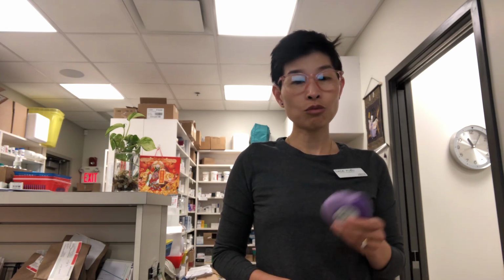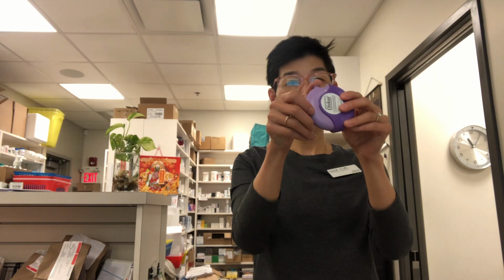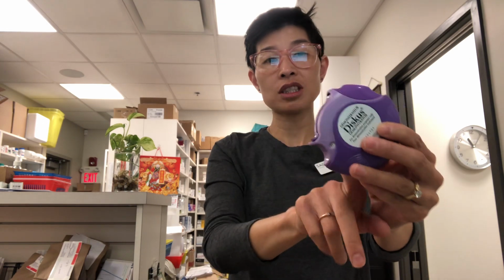I'm one of the pharmacists here, and today I'm going to show you how to use the diskus. So, number one thing you want to do with the diskus is to prepare the medication for inhalation. So you want to put this open, puncture the blister. So the medication's in here already.